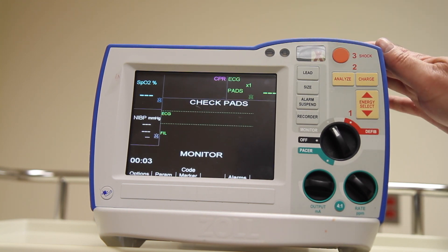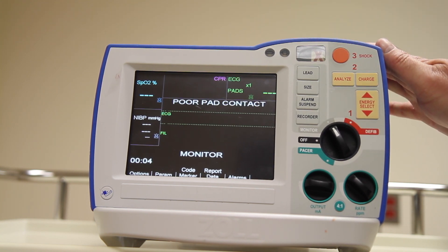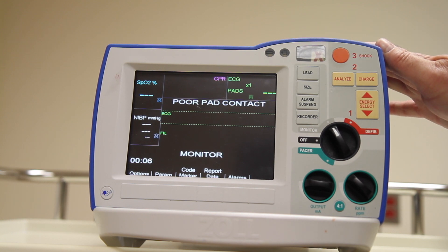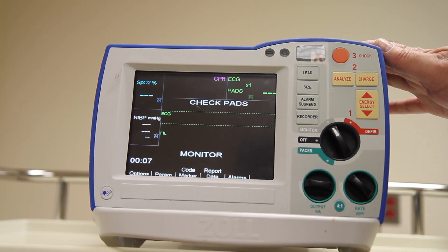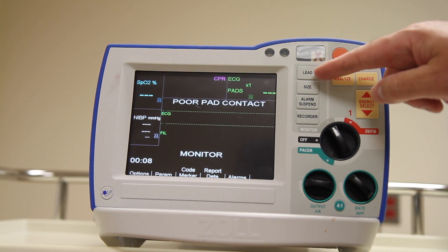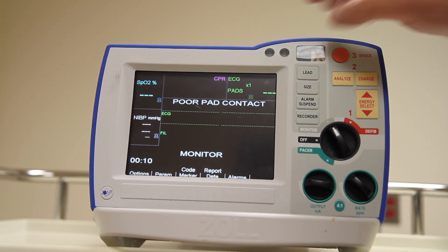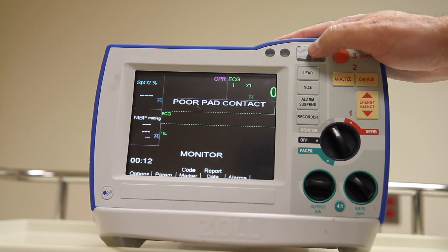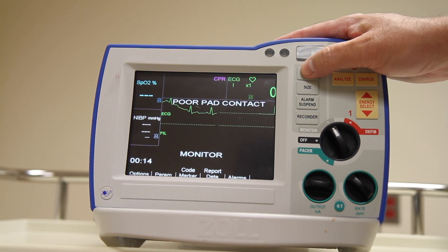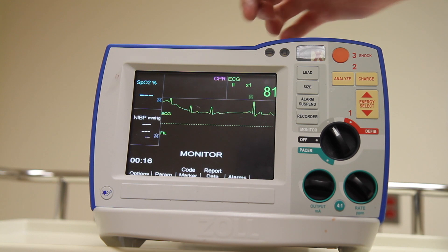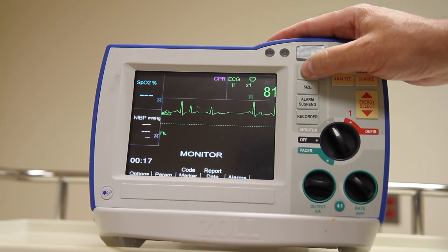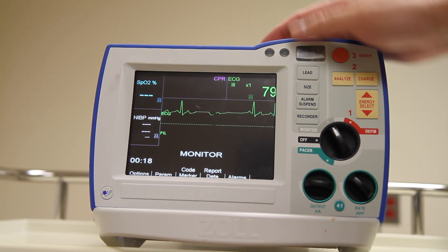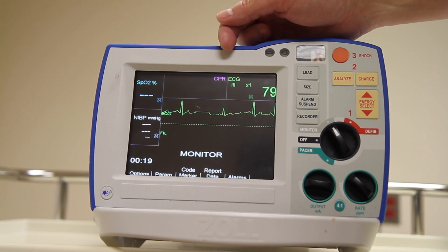Our device, as I said, defaults into hands-free pad mode. I can switch it to limb leads by using the lead selector button and pressing it once for lead one, a second time for lead two, and a third time for lead three.